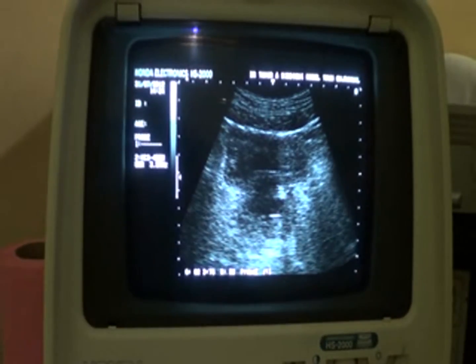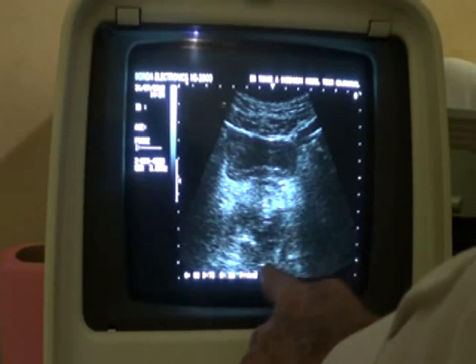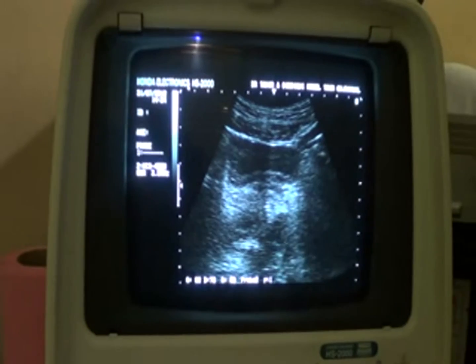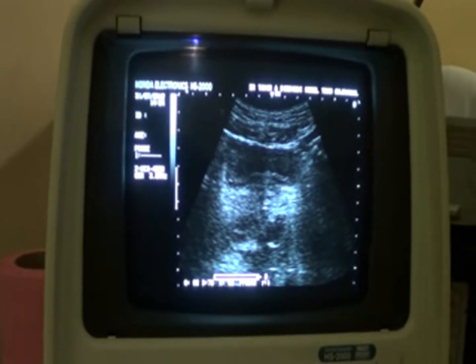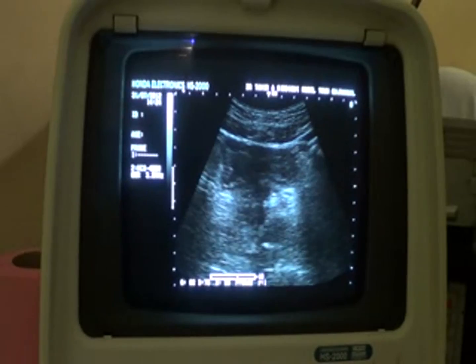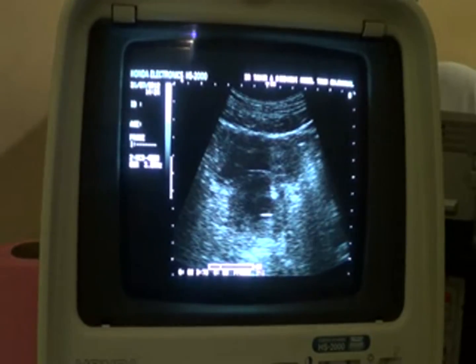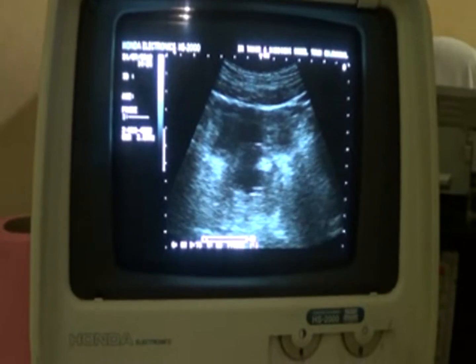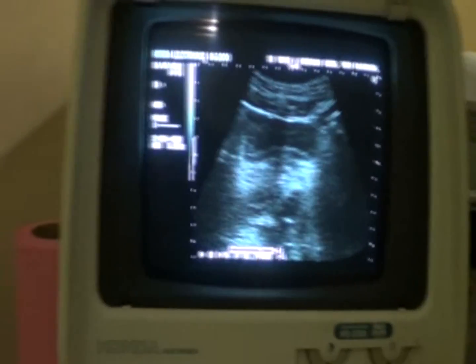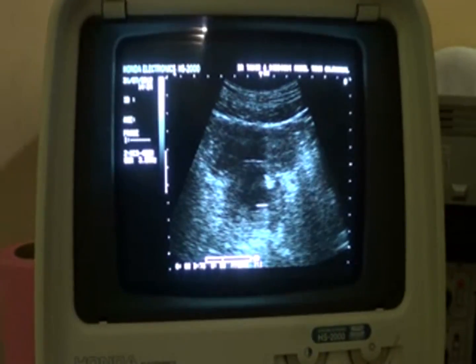And this is the anterior one, and this is the posterior focal lesion, the abscesses. Here you see the anterior, the posterior. So in this section we see that the post-micturition residual volume is within normal. There is no urinary bladder outlet obstruction. The urinary bladder is clear. Periprostatic fat is intact. The prostate is intact. There are two focal lesions seen with marginal and internal calcification and debris, consistent with abscesses in a normal-sized prostate. Thank you.